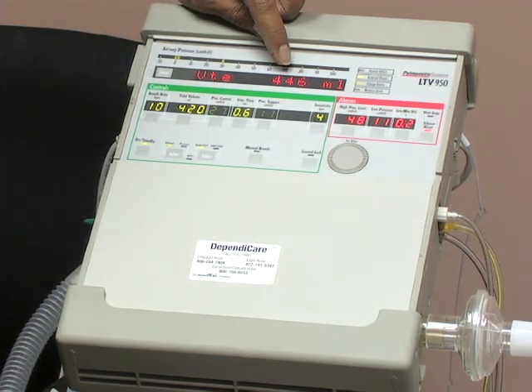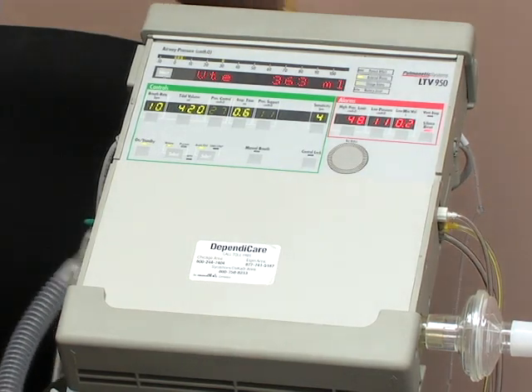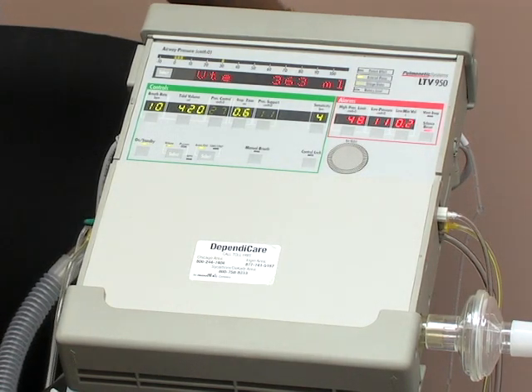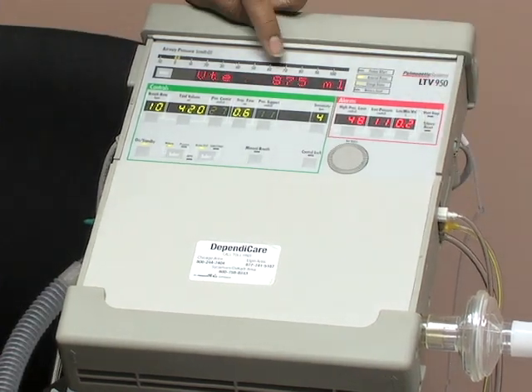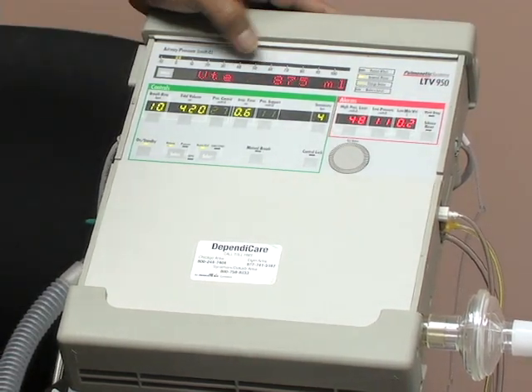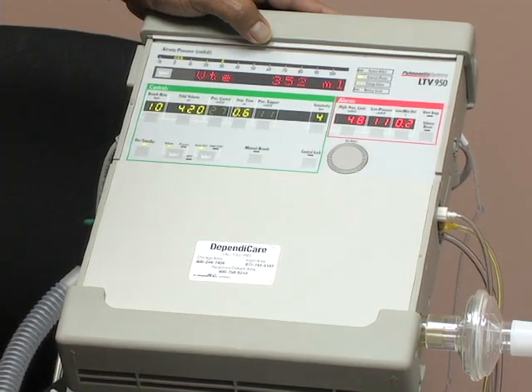This number can also be higher, as you see. If a client coughs, it can cause a high pressure alarm, and it can also show a number quite higher than what's prescribed. That's because when he coughs, he adds in some air to what came out and shows a higher expired volume, and it's a temporary scenario.